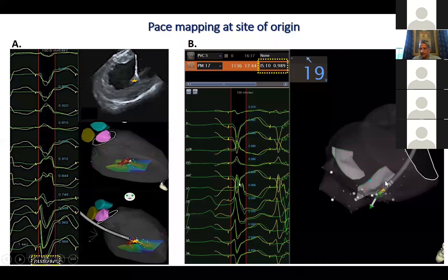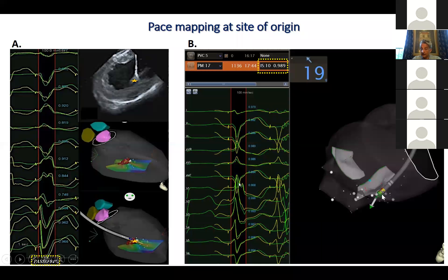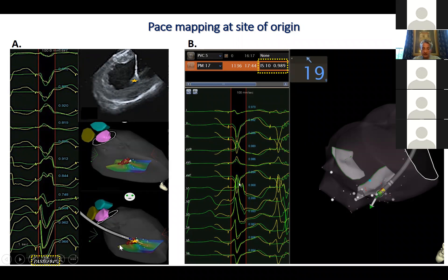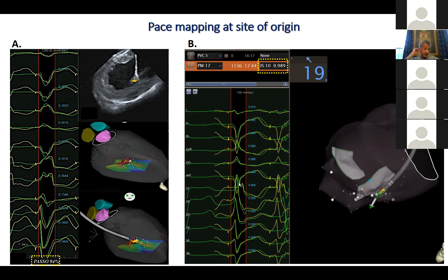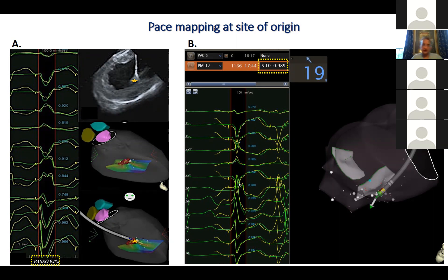Here's another example, also a posterior medial papillary muscle PVC, where the catheter is nicely tucked onto the pap with a contact force of about 19 grams, and the pace match is close to 99%. But the bottom line is we don't always get such good matches. Part of the reason is the mechanism of these arrhythmias. Sometimes the Purkinje source is deep in the papillary muscle, and at the exit site where your catheter is, you're capturing the adjacent part of the muscle, so the QRS complex match is not great.